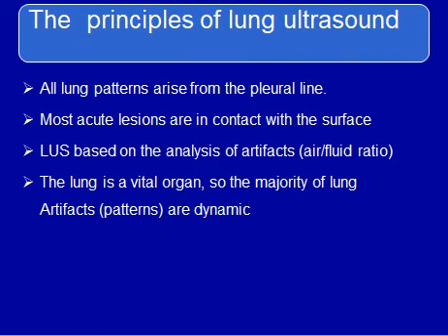What is the principle of lung ultrasound? All lung patterns arise from the pleural line. Most acute lesions are in contact with the surface. Lung ultrasound is based on the analysis of artifacts and the air-fluid ratio. The lung is a vital organ, so the majority of lung artifacts or patterns are dynamic.